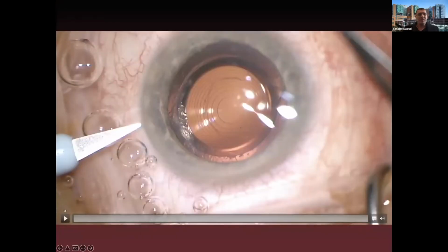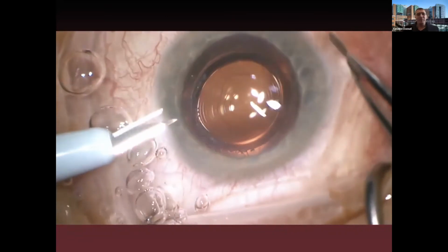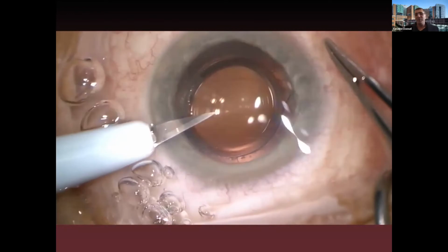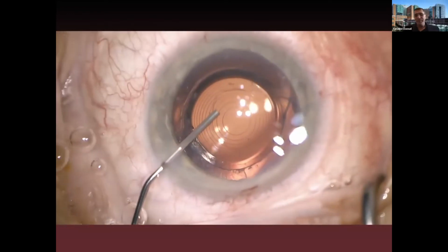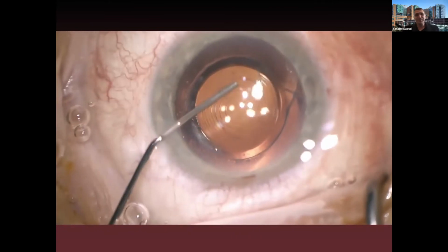And of course, my time is up. So what does this patient get? This patient gets basically removal of the lens and just replacement with a monofocal IOL. Thank you for your attention, and I'm happy to take any questions or discussions.